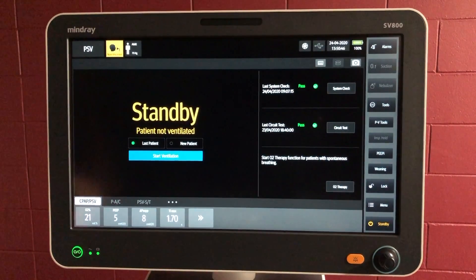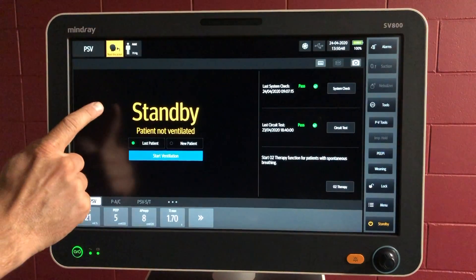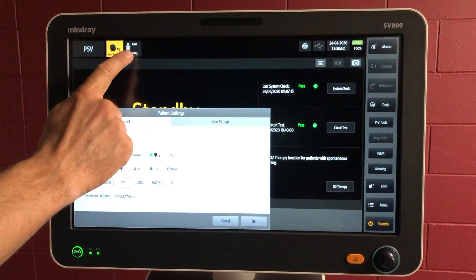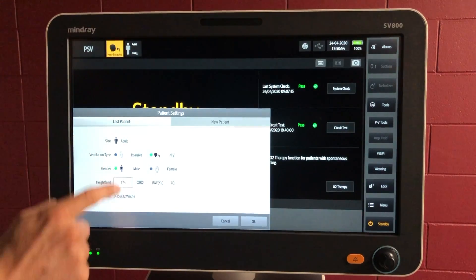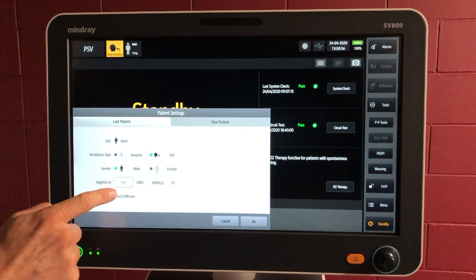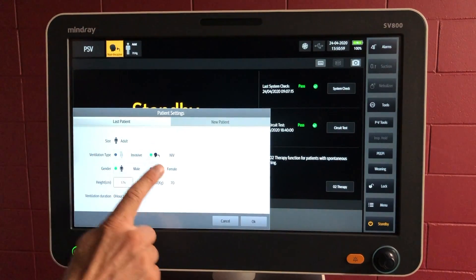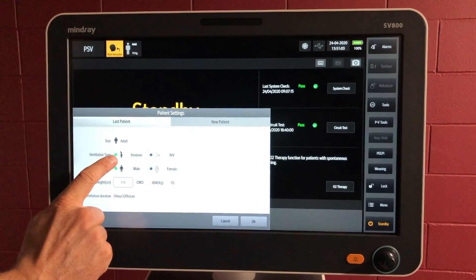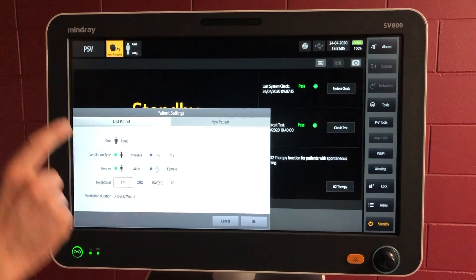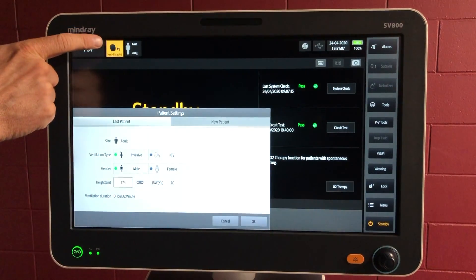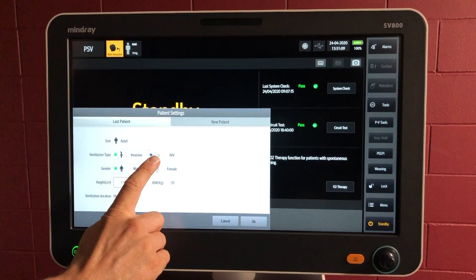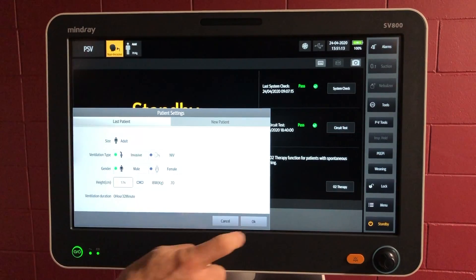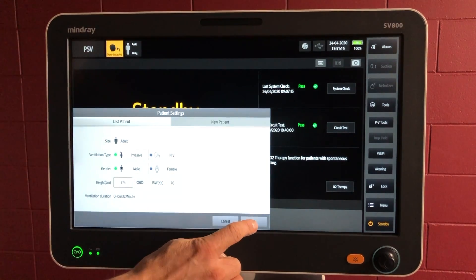So while the patient is being intubated, we can choose the last patient and touch on the patient parameter here. It is the same patient, a male of 174 centimetres, but we're going to change from non-invasive ventilation to invasive. So we're going to pop that button there — invasive — and this symbol here when we start up is going to change from the mask to the ET tube. So let's go OK for that one.